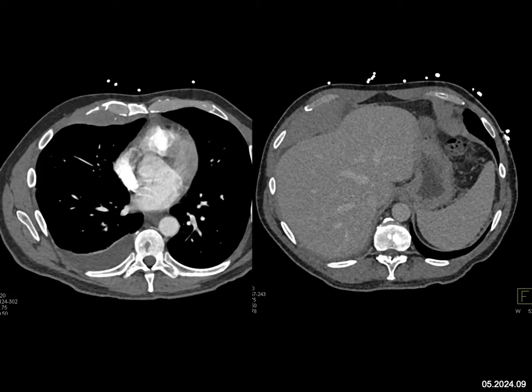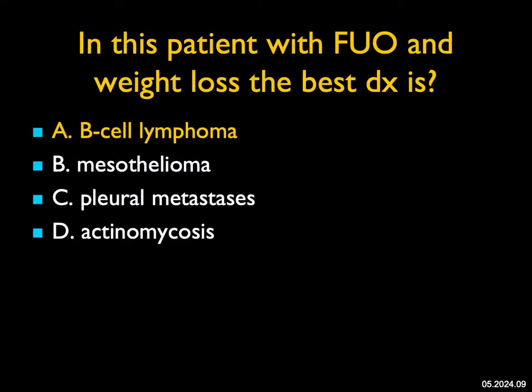The imaging looks like a younger patient. Pleural mets is a thought — you can get unilateral pleural mets in a patient with thymoma — but I don't see an anterior mediastinal mass. Actinomycosis can cause chest wall erosion and destruction, but usually it's focal, and I don't see any chest wall or rib destruction. The best answer is lymphoma. Lymphoma can involve the pleura, and this was a great case of B-cell lymphoma.